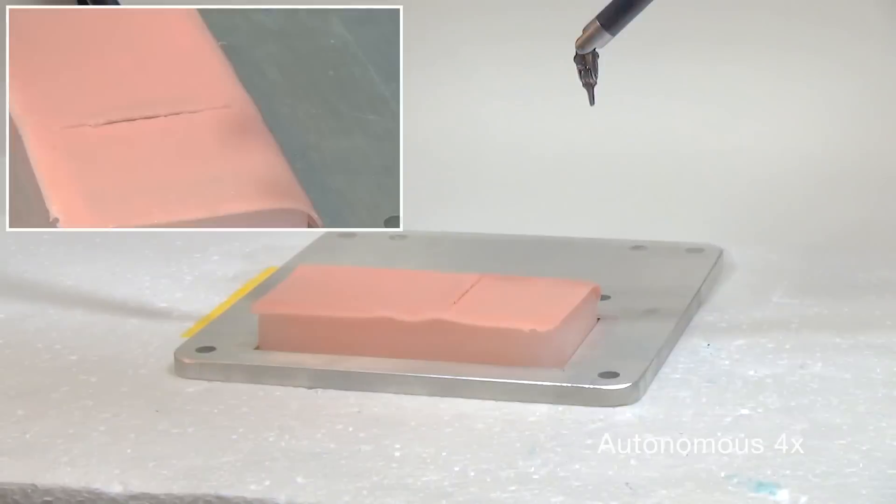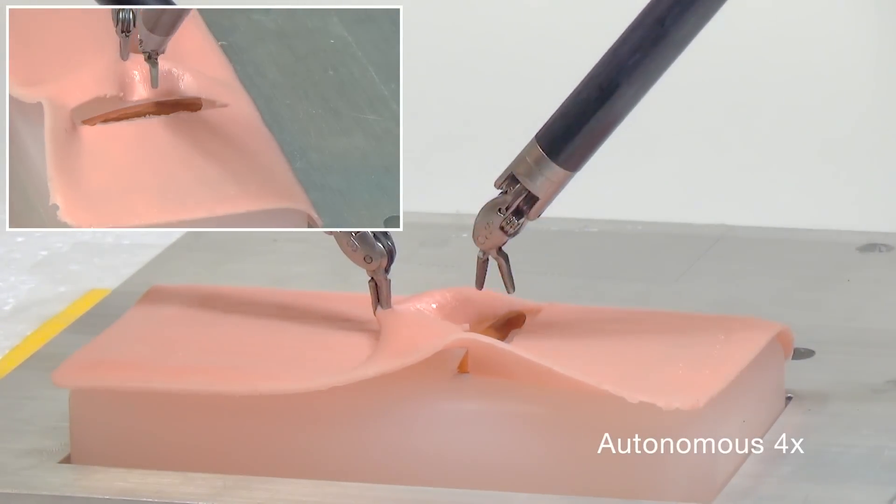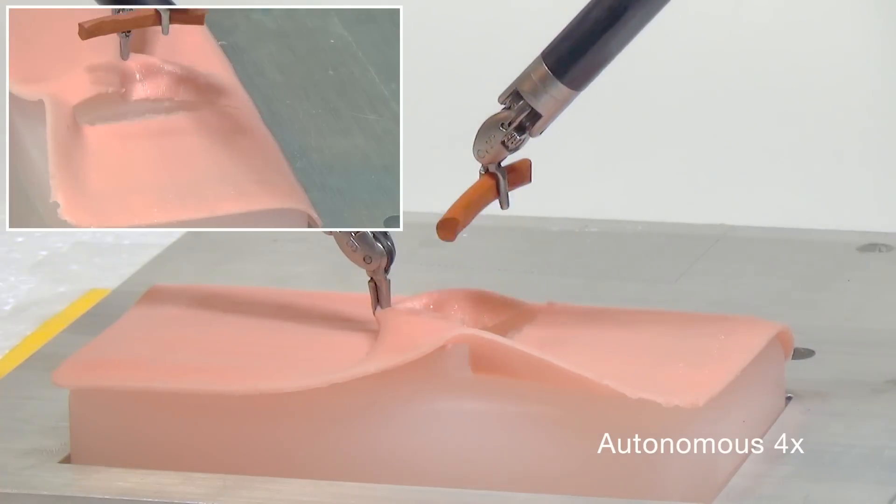The next steps are retraction and tumor debridement. One gripper retracts the skin to expose the tumor, while the second gripper reaches in to detach and remove the tumor.